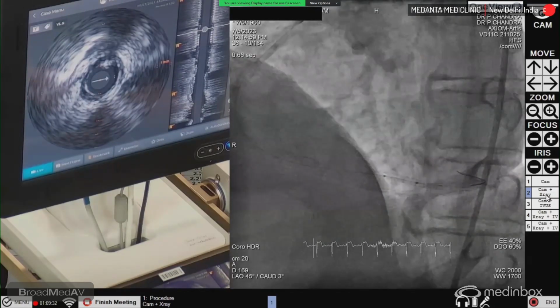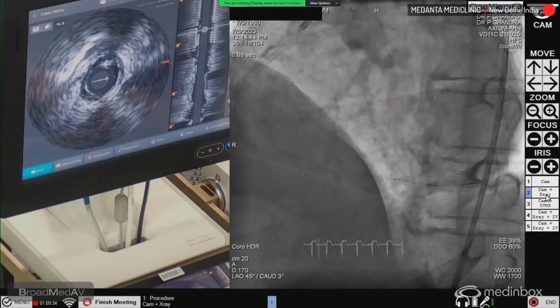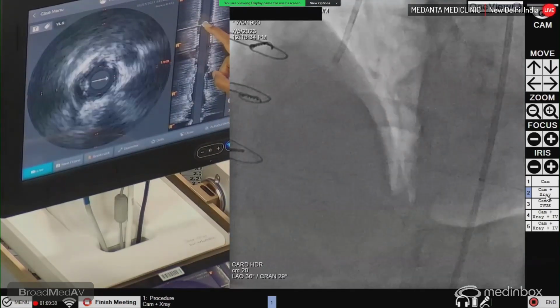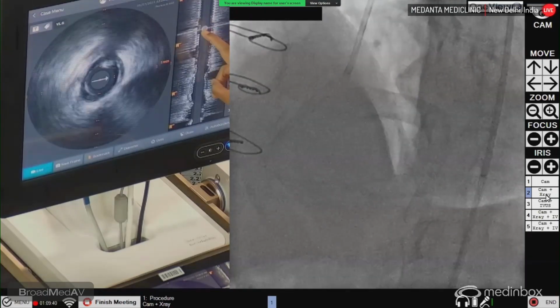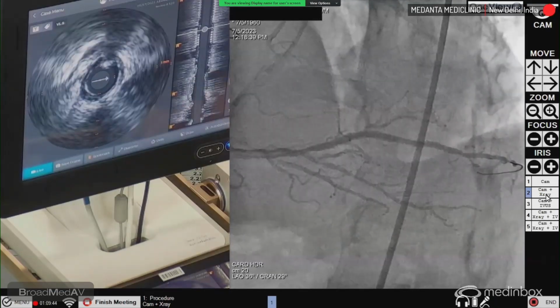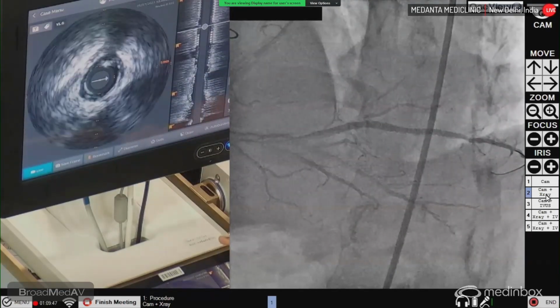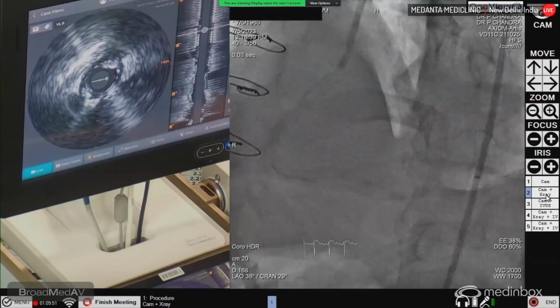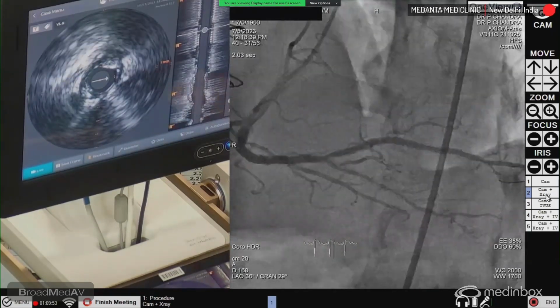Go back. We can take an angiographic image over here before we think of putting another stent, because there is some disease just distal to the stent. Show the distal. There is a calcified plaque and nodule just distal to the stent. We can put a 2.5 into 8.